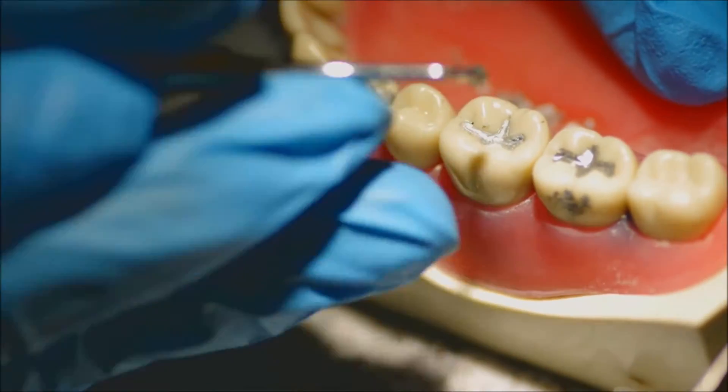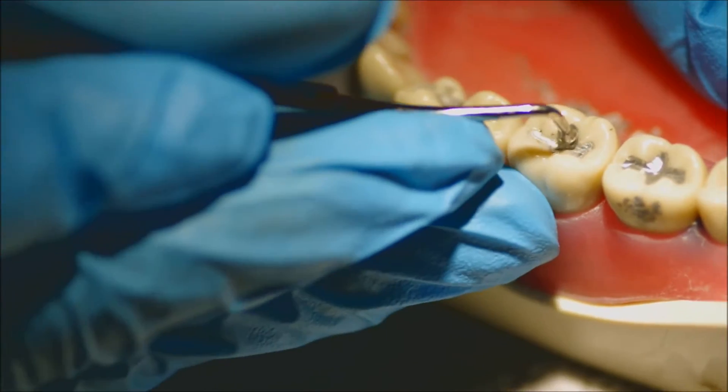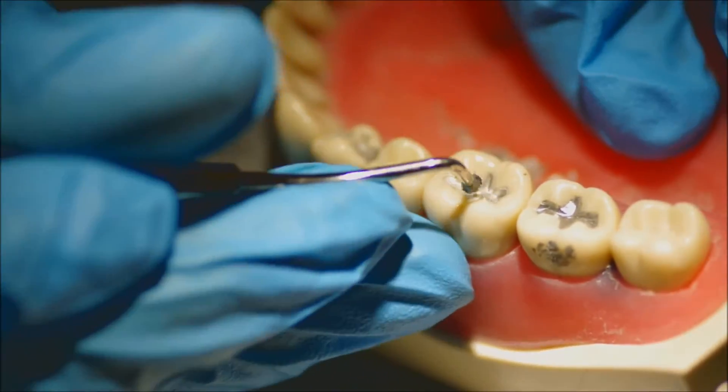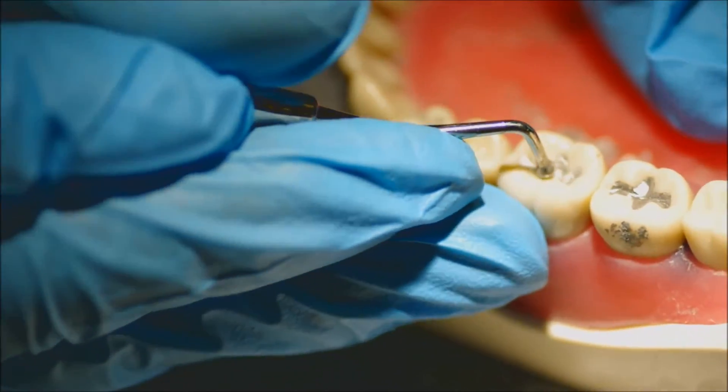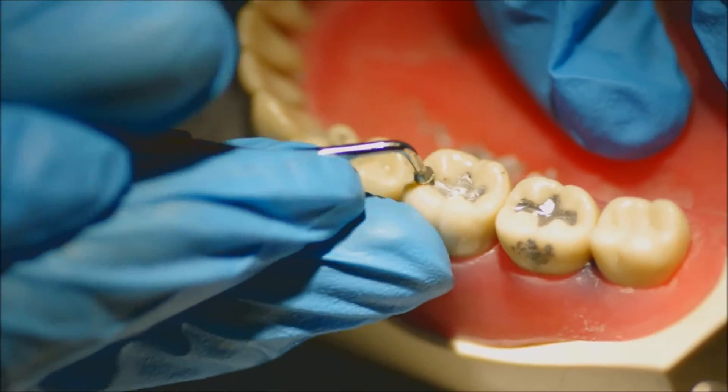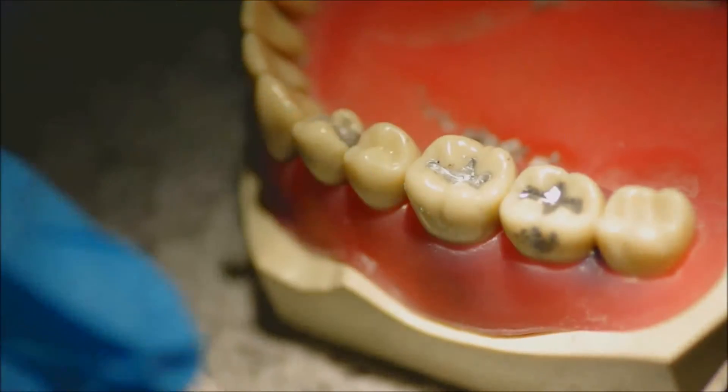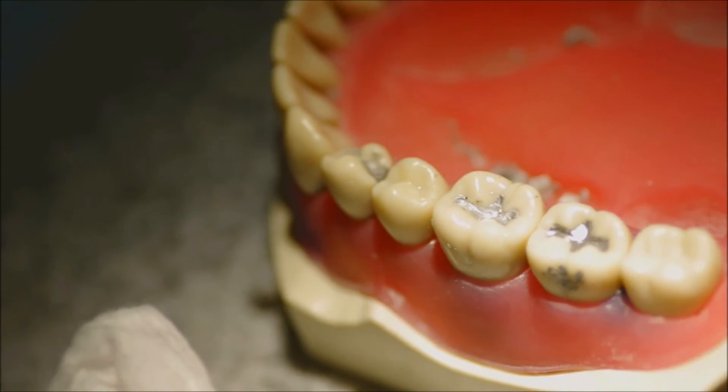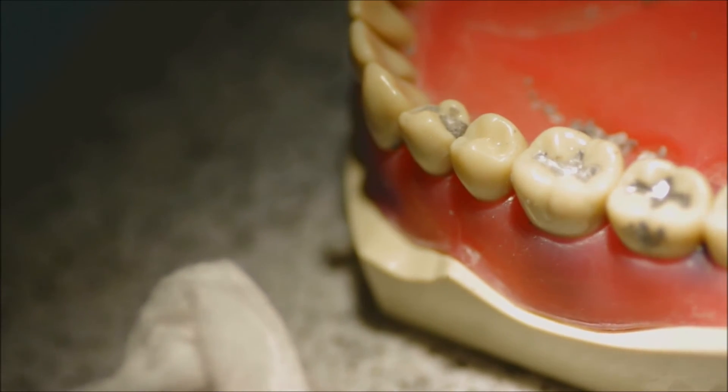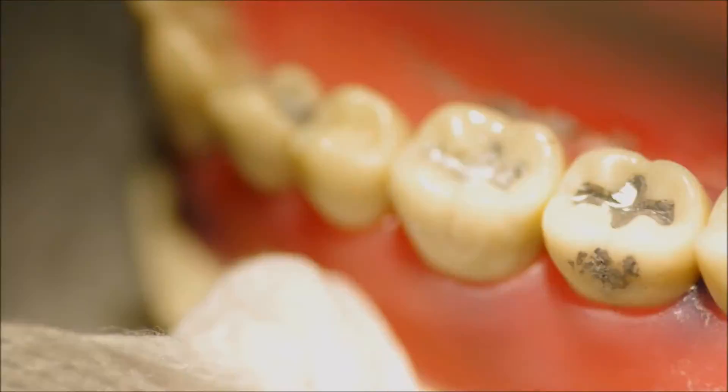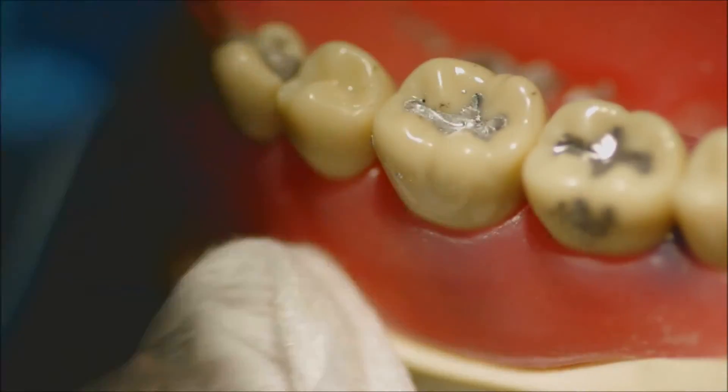I decided that it was not enough anatomy for me, so I went back to my acorn and re-carved the grooves. Remember, if you overfill your amalgam, you will have the ability to carve it multiple times. You won't run into a void, but if you underfill the amalgam to start with, you have a void before you can even get your first initial carving.